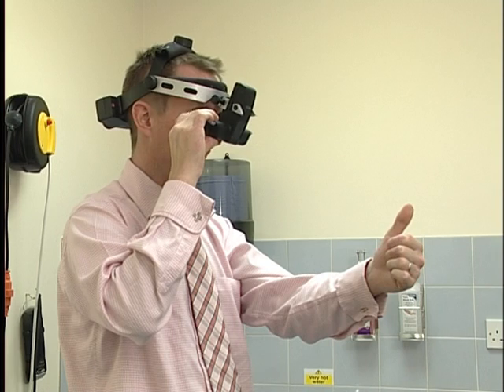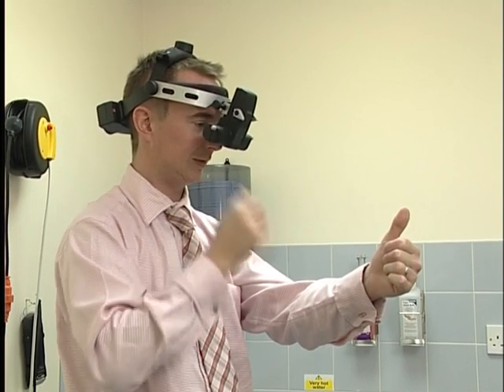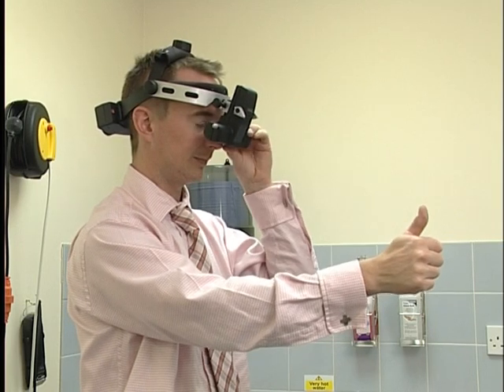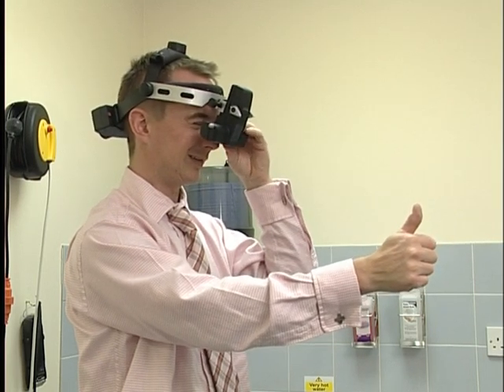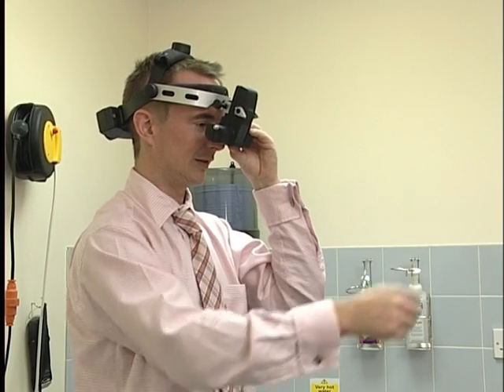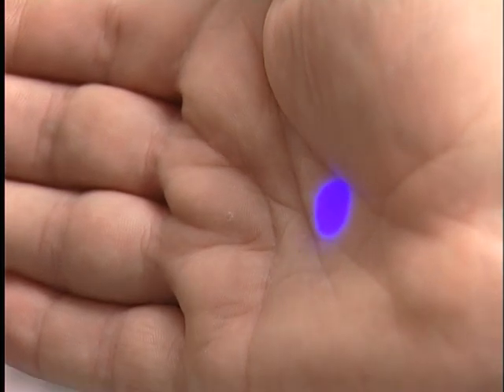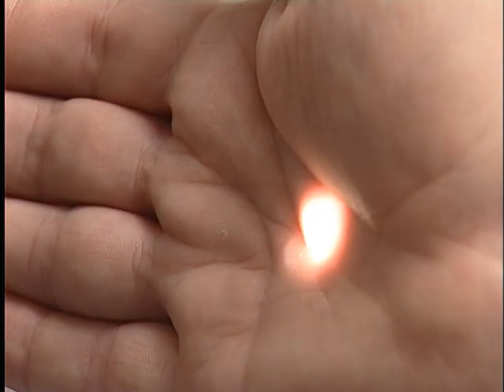Using the thumb and forefinger of the opposite hand, slide the optic of the open eye, located directly under each eyepiece, so the object moves into the centre of the field of view. Keeping the object in the centre of the light patch, repeat for the other eye. The light beam may then be selected depending on the pupil size and experience of the examiner.